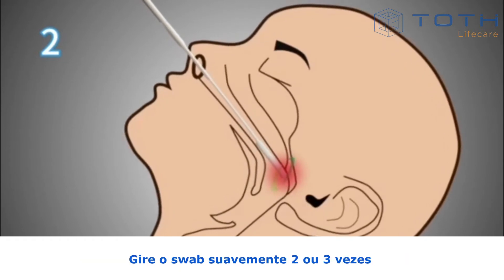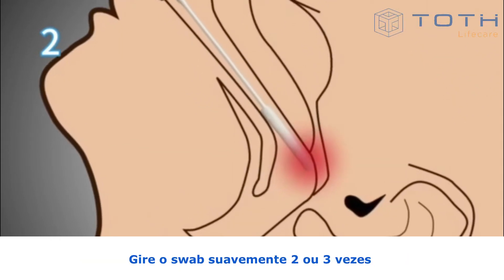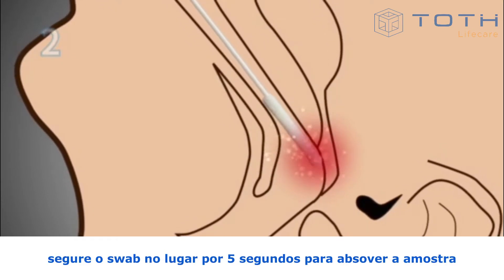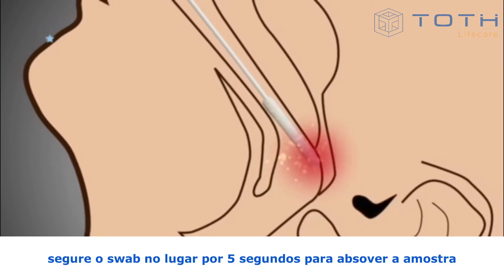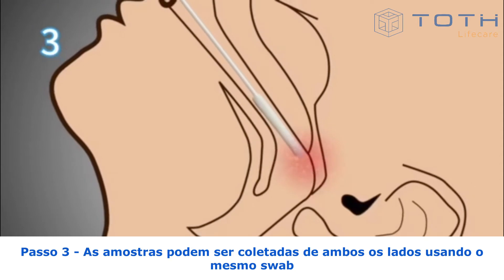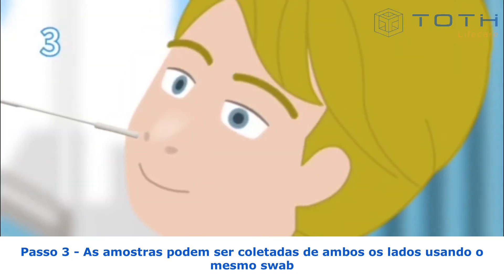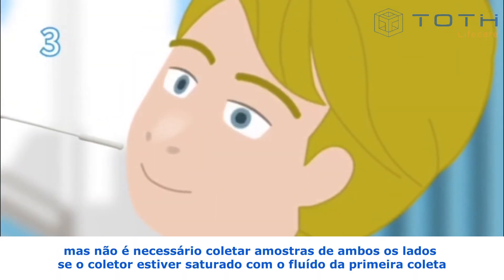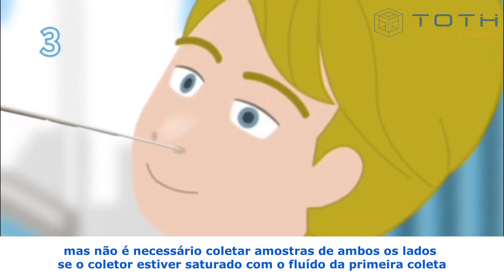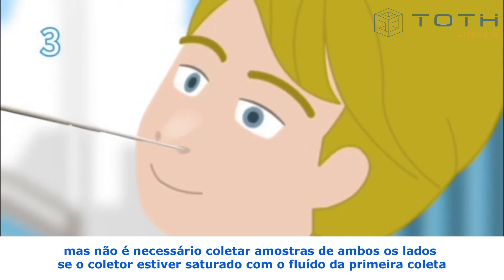Rotate the swab gently two or three times. Hold the swab in place for five seconds to absorb the specimen. Step 3: Specimens can be collected from both sides using the same swab, but it is not necessary to collect specimens from both sides if the mini-tip is saturated with fluid from the first collection.